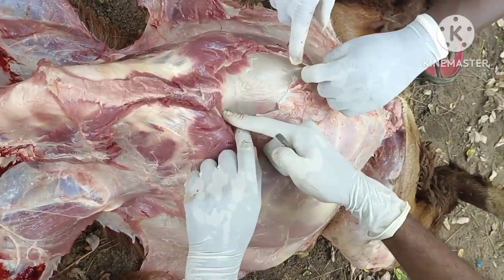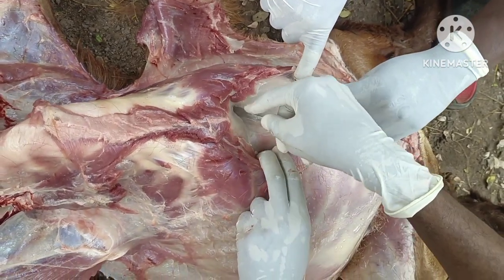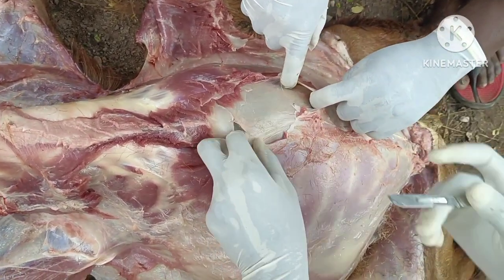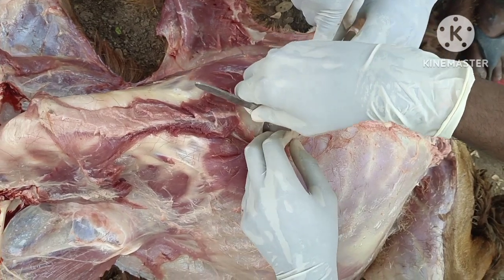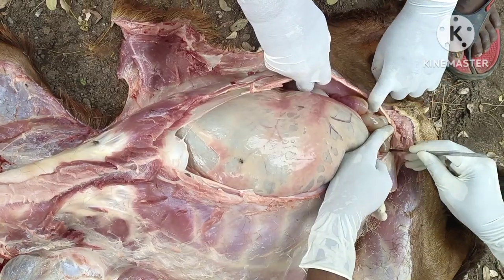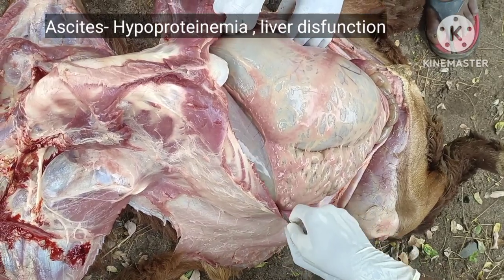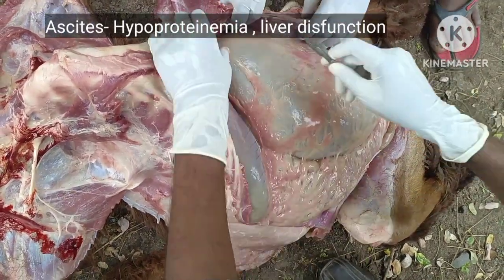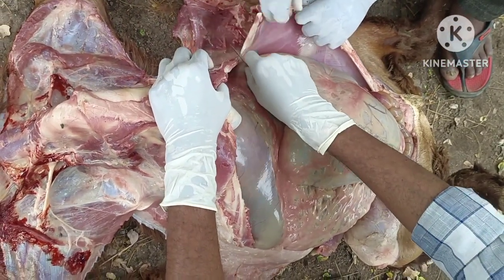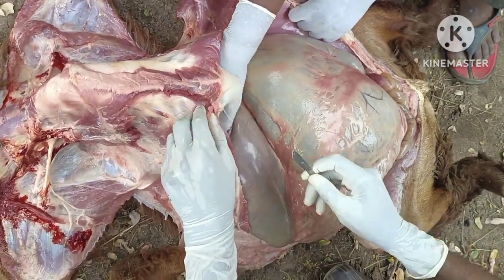Locate the sternal cartilage, that is the xiphoid cartilage of the sternum, and just beneath that make an incision. Without puncturing the internal organs, cut the peritoneum and look into the internal organs. At this point, if we find any fluid in the peritoneum, then we can say that it is ascites, and it may be due to hypoproteinemic conditions and liver dysfunction, which may lead to the accumulation of fluids in the peritoneum.